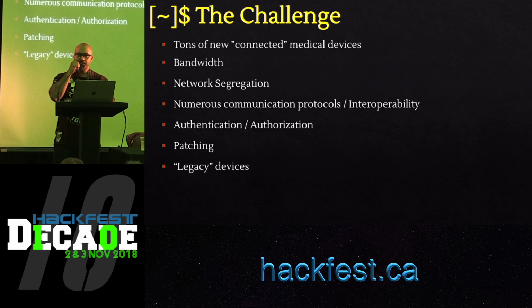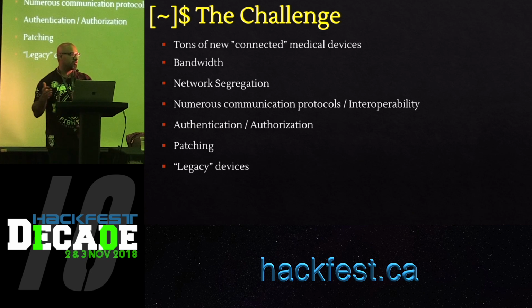Also, he mentioned that from their CISO's perspective, because they still have unpatched systems, older operating systems on their medical devices, the CISO's priority is to patch those systems. Their priority is to patch or get rid of Windows XP, Windows 2000, 2003, and not the medical devices. So we'll get to the medical devices, but it's going to take a long time to get there, which is an interesting conversation to have.